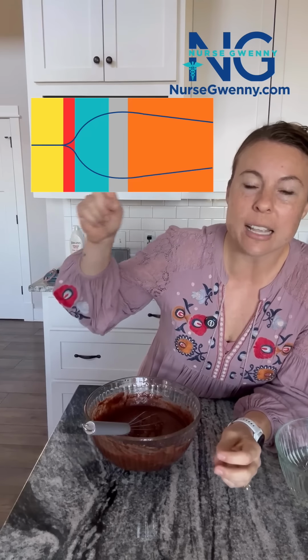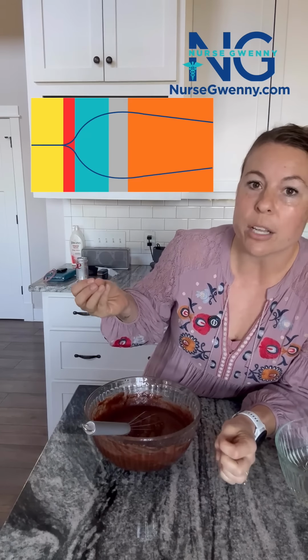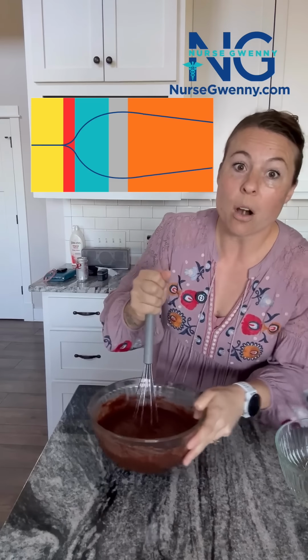Now, here's an example of a TEG, and you see it kind of looks like a wine glass. So that straight line is how long it takes the blood to form a clot, and then you see that curve outward. That's more oscillations because the blood is getting thicker, and then as it thins out, that's how quickly the clot starts breaking down.